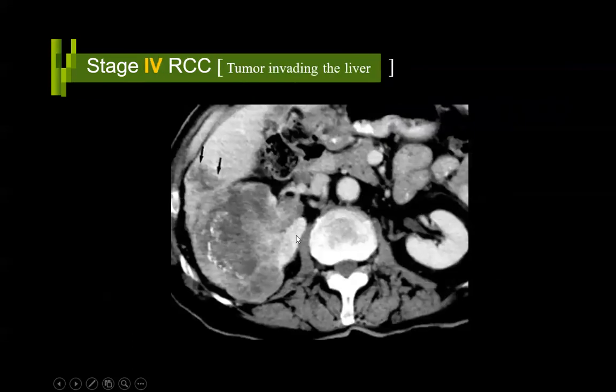This is a tumor in the right kidney. It has gone beyond the Gerota's fascia and has locally invaded the liver. So obviously there is local spread. So if it goes beyond the renal confines, beyond the Gerota's fascia, and invades the surrounding viscera, it is stage 4.